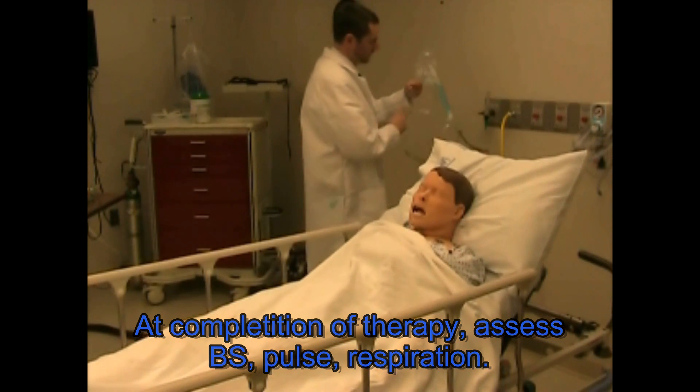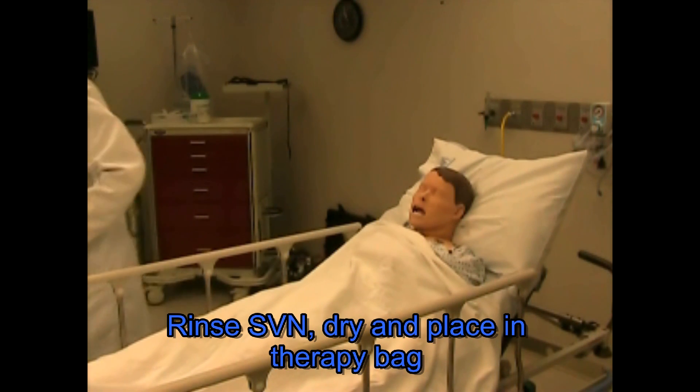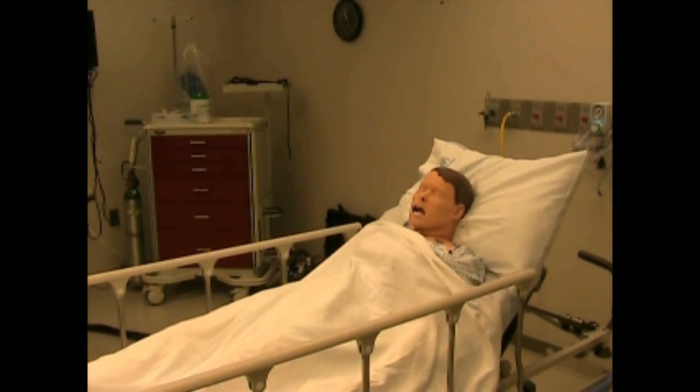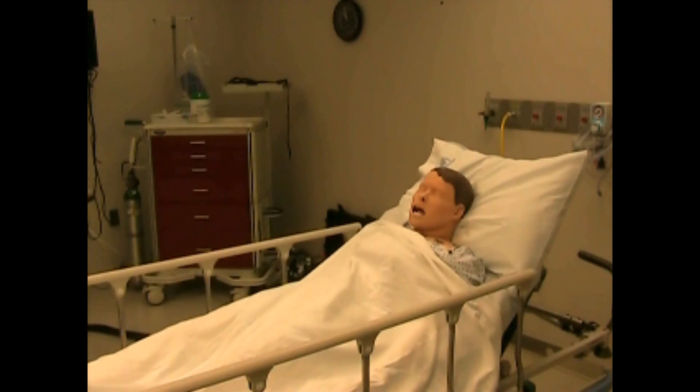During the treatment you may need to monitor the vital signs. Measure peak flow in asthmatics before and after. Encourage the patient if they're cooperative to cough and note sputum production. Assess the effectiveness of the treatment if the patient is alert, and terminate the therapy if there are any adverse reactions — dizziness, vomiting, nausea, or any significant increase in heart rate. You may also want to have the patient rinse their mouth if you aerosolize steroids. Shake out the nebulizer, rinse it with sterile water, and preferably dry the nebulizer with a purge of gas for a brief few minutes, then return the nebulizer to the treatment bag.